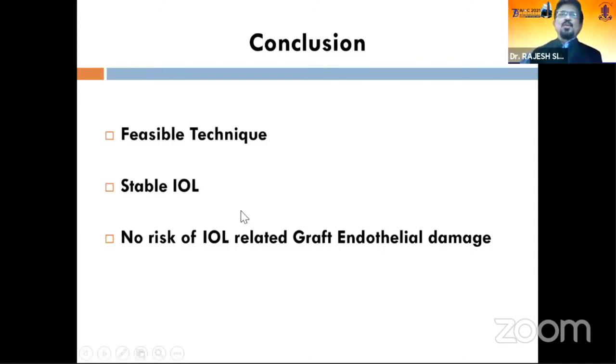So what I would like to conclude by saying is that this combination of endothelial keratoplasty with the glued IOL technique is a feasible technique. The IOL remains stable. You do all the procedures, the IOL doesn't move.